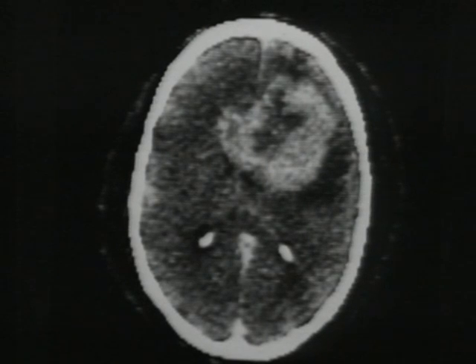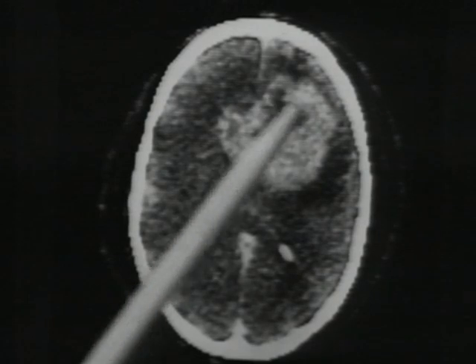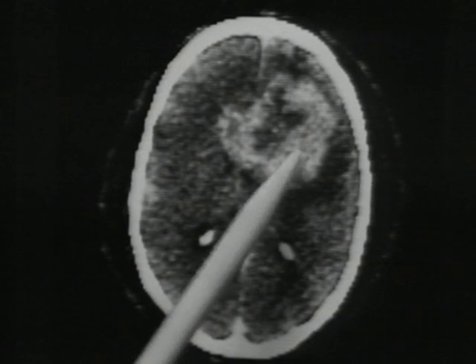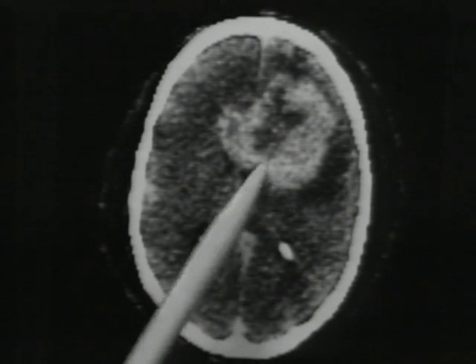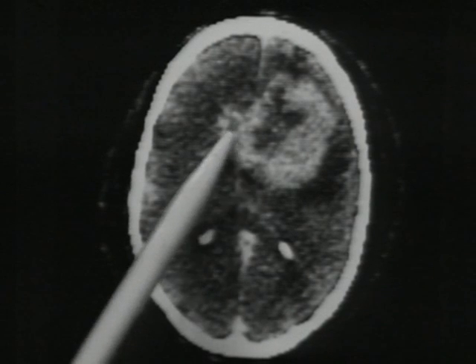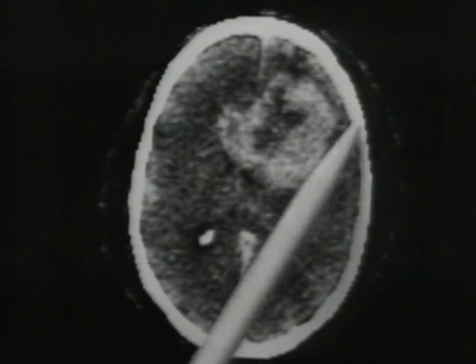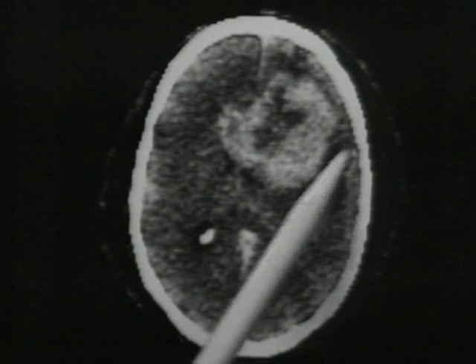tissues. Now here we have a patient with a typical malignant glioma. The density of the malignant tissue has been enhanced with Conray, and you can see how it comes backwards. It has greatly deformed the anterior horns of both lateral ventricles. It has invaded the genu of the corpus callosum and extended across the midline into the medial aspect of the left frontal lobe. Behind it you can see where there is soft edematous brain.